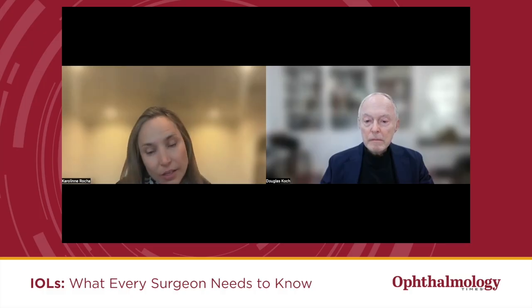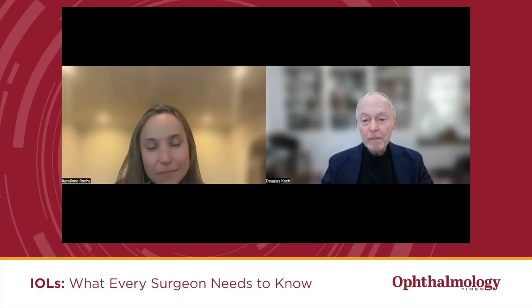And then you can fine tune, because if the patients want a little more reading, with the same category, you can offset just a little bit, minus 0.5, minus 0.75. What is really nice about this category is that the distance vision is still really good. If you target the non-dominant eye at minus 0.75, that patient will see 20/30, 20/25, and they can definitely benefit from this extended range. They have really enhanced my practice a lot in terms of what I can offer patients.